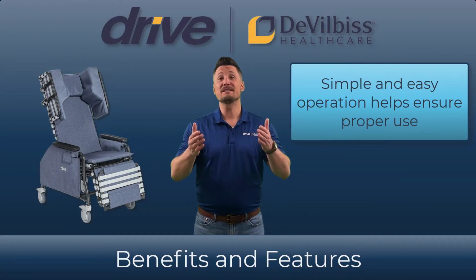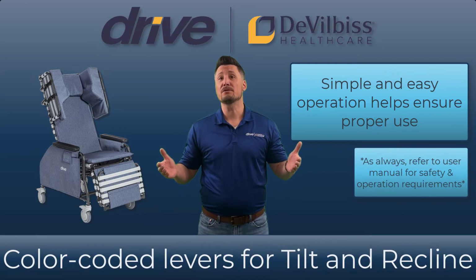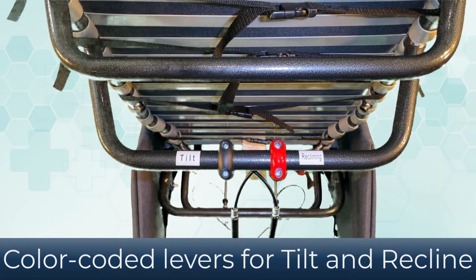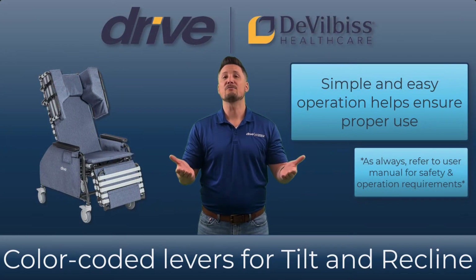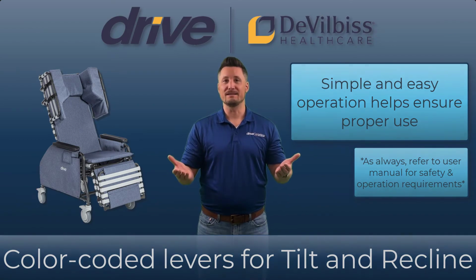Operating the Rose chair is easy and intuitive, ensuring proper use, in part due to the color-coded levers, which include a red lever on the right for recline and a black lever for tilt. Best practice when your patient enters the chair is to first tilt, then recline. When returning to upright, use recline followed by tilt.